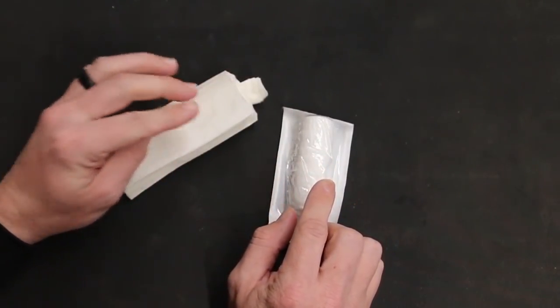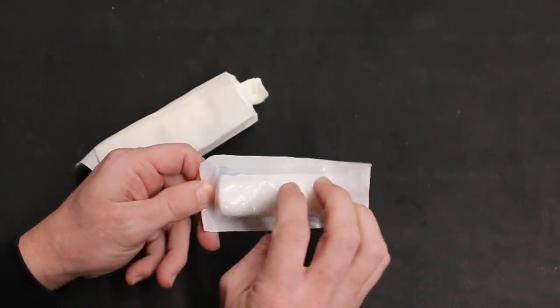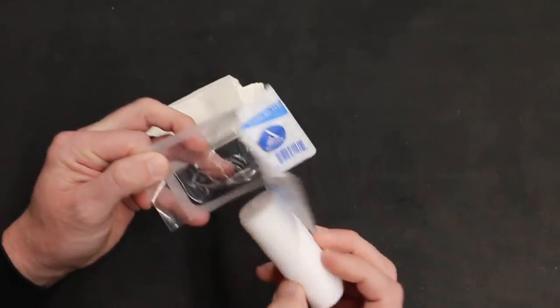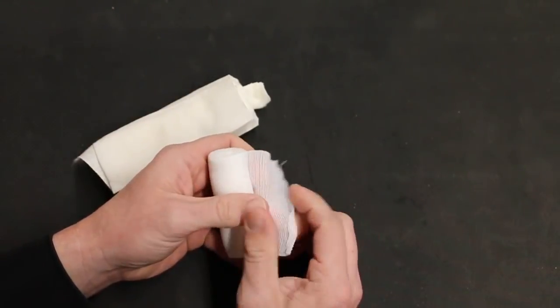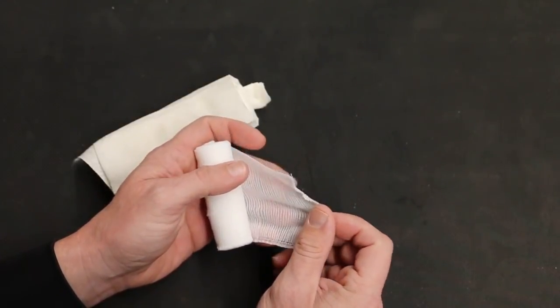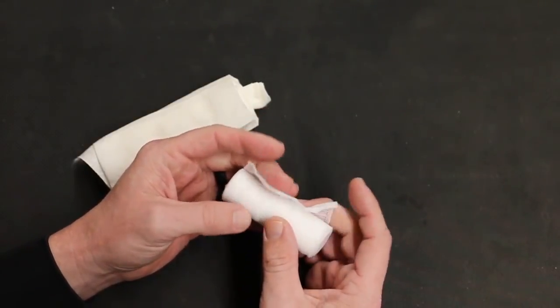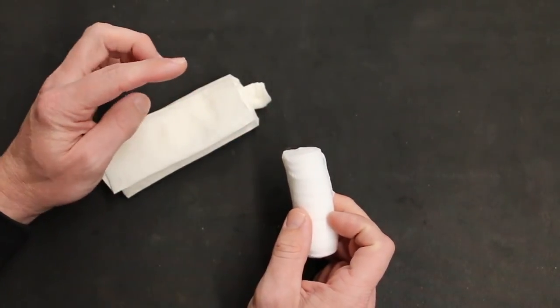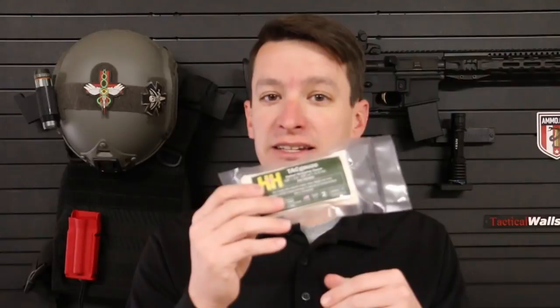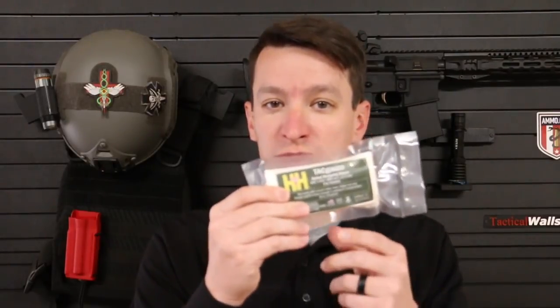Another advantage of TAC Gauze over a roll of cling is that trauma surgeons don't really like cling because it tends to leave small fibers inside the wound that they have to go back and remove — it's a pain to clean out after you've controlled bleeding. TAC Gauze by H&H doesn't leave those little fibers. It's a non-hemostatic gauze made from a blend of different cotton gauzes, and H&H says it has better absorption and a better ability to control bleeding than regular compressed gauze.